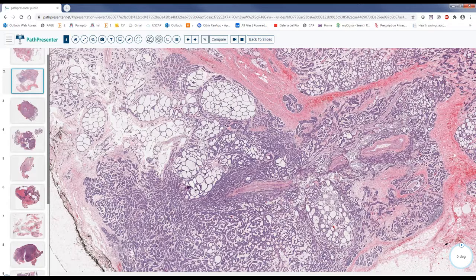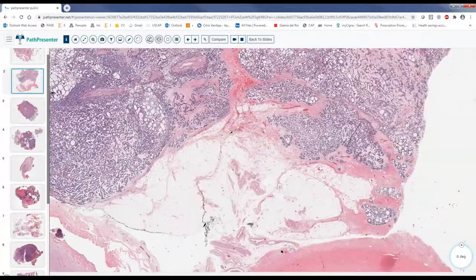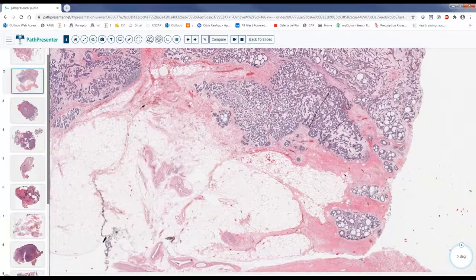Usually when it is high grade, it will have a lot of mitosis, a lot of necrosis, very invasive, and all the other changes that we see in high grade. The other problem is that it may have skip lesions. I've seen areas of salivary gland tumor, and then you find an area of tumor again here, so it skips.